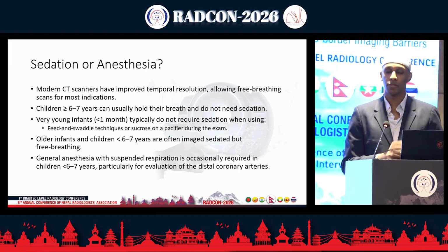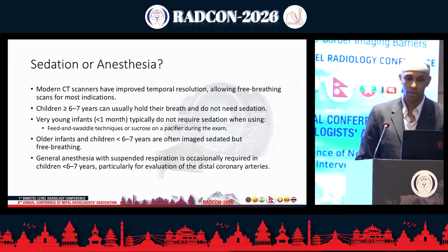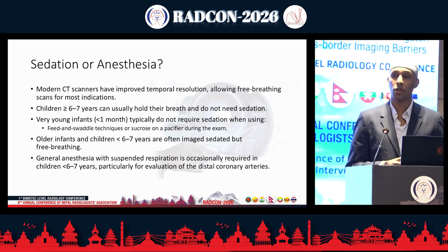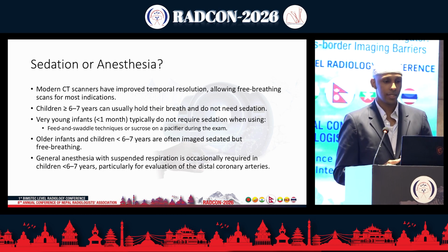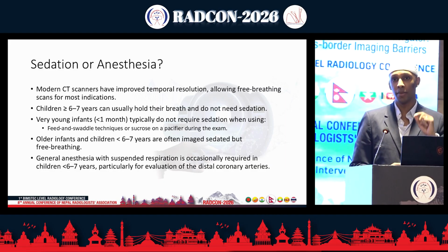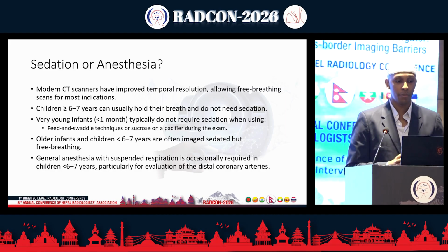The next question, following how was your patient referred to you, is whether or not you use sedation or anesthesia for a pediatric patient. Modern CT scanners have improved temporal resolution, allowing free breathing for most scans. Children who are older than 6 to 7 years old can hold their breath and usually do not need sedation. Very young infants typically do not require sedation if you use feed and swaddle techniques, and also give them a little bit of sugar on a pacifier so that they're at least satiated for the time being.